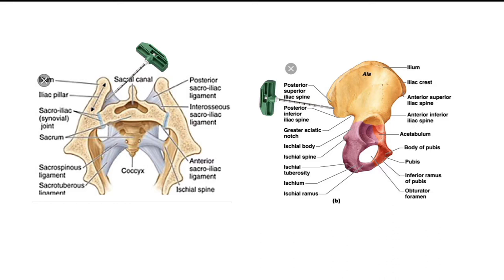The entry point is in between the PSIS and the inferior posterior iliac spine. The trajectory is very low — more flat than the regular iliac screws — but you end up exactly in the same area.